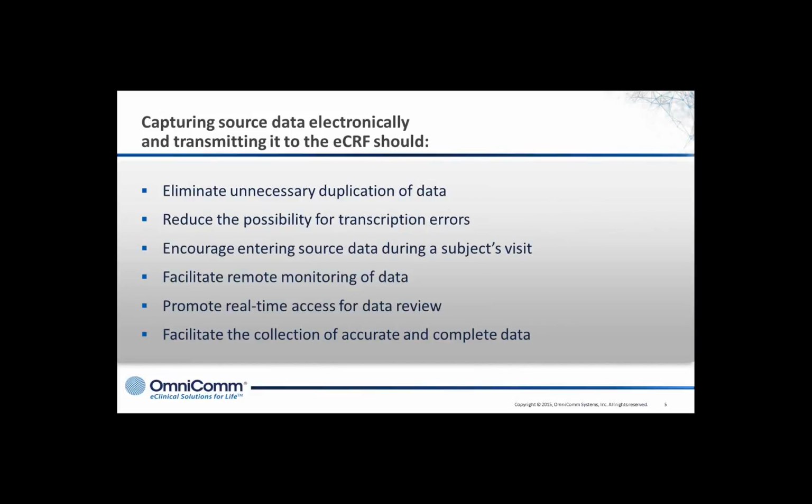So we wanted to reduce errors, eliminate the duplication of data, including double data entry, which is also error-prone, make sure that data was collected contemporaneously, so at the time that it's supposed to be collected per the protocol schedule. We also wanted to give the appropriate people immediate and direct access to the data in real time to increase safety, to increase data quality, and decrease errors and inefficiencies.